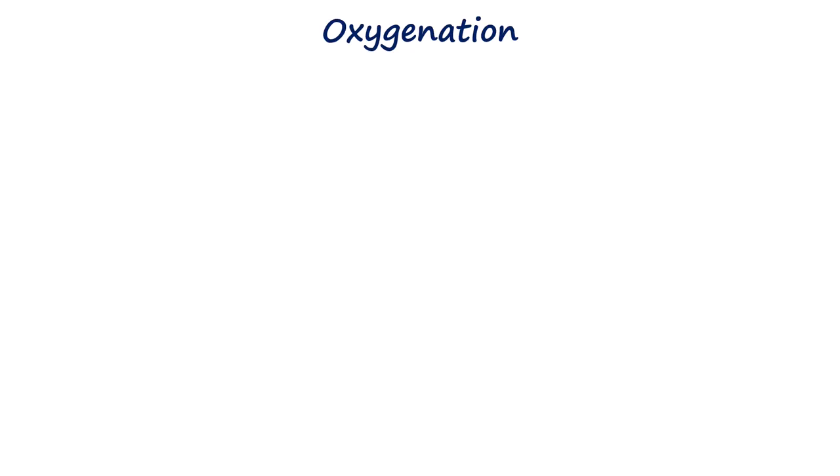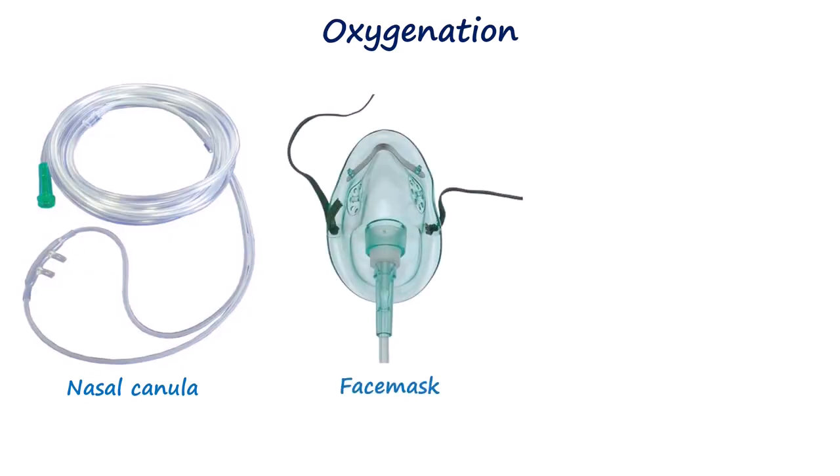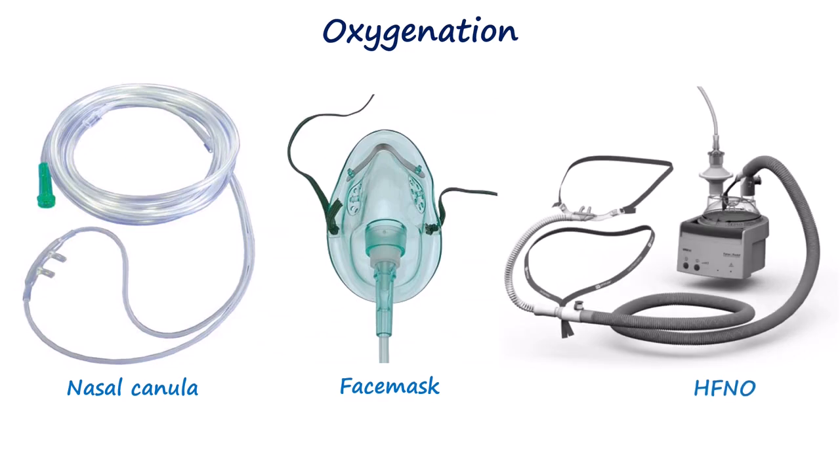Oxygen can be administered via standard nasal prongs or a nasopharyngeal catheter and face mask. High-flow nasal oxygen is particularly effective, as it delivers a continuous flow of humidified oxygen and provides a small degree of positive airway pressure, which helps delay desaturation.